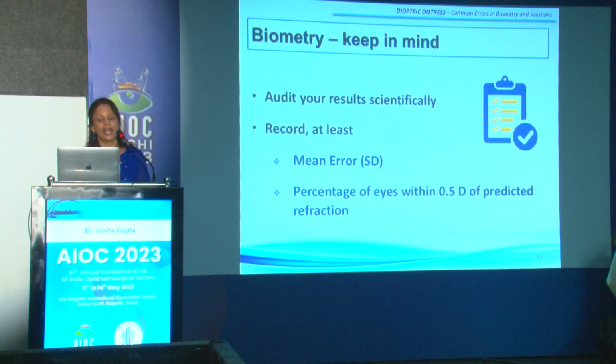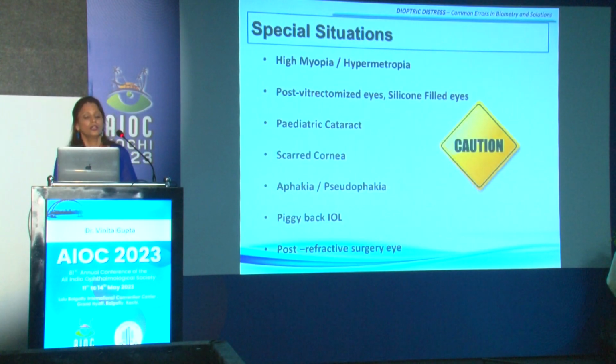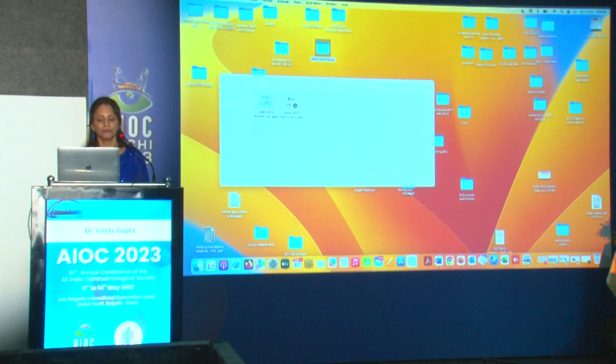Audit your results scientifically, record your mean errors and use them to optimize your results. And there are suboptimal eyes, which my other co-instructors will be talking about. These are those conditions which will be discussed in the subsequent talks. I'll next shift to my other talk, on optimization, which continues from this.